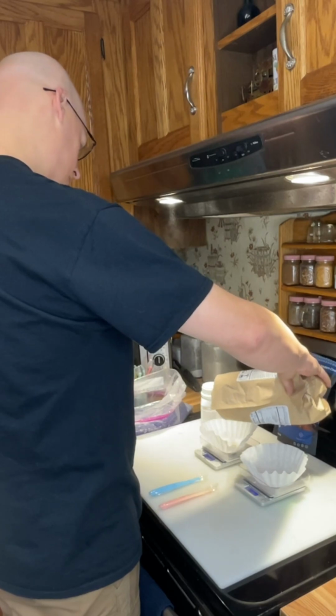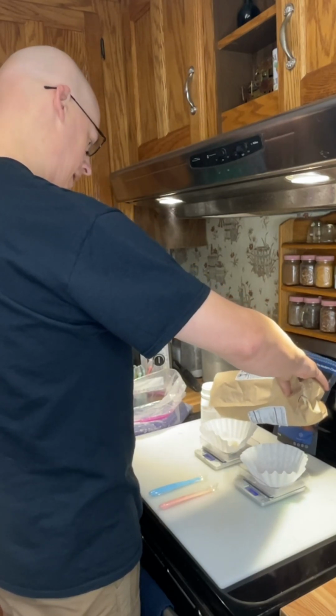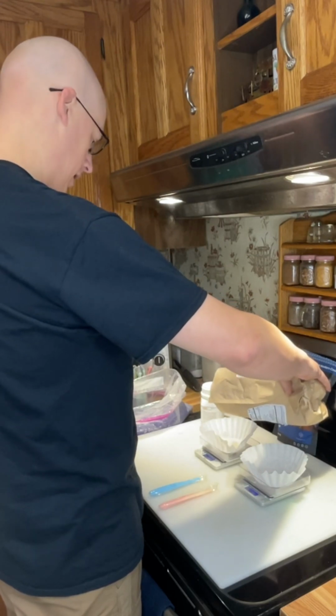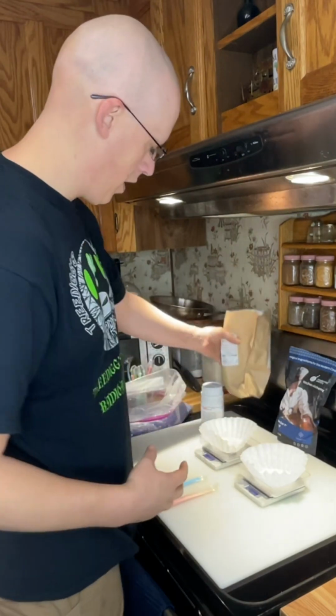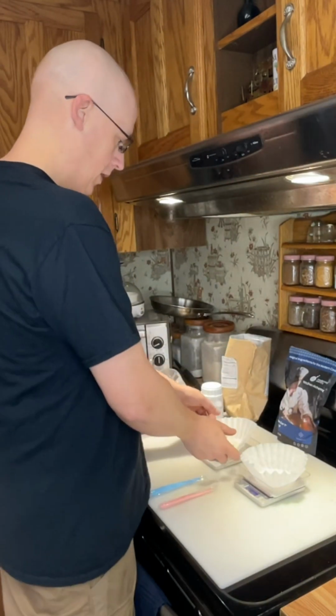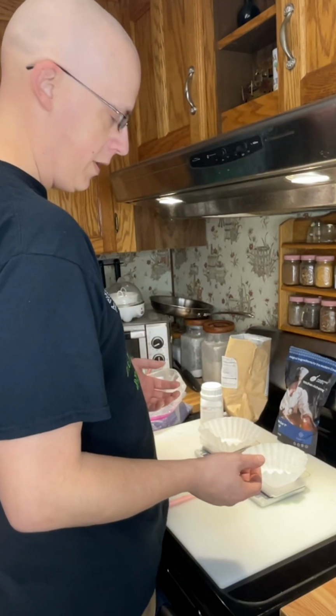And why I say with this batch is because I've found that with different batches of different types of agar, you can get different gelling rates. And in this one, I've figured out that it's a little bit stronger of a geller than others. So I've put 8.9 grams in there. That's all I'm going to do for this one.